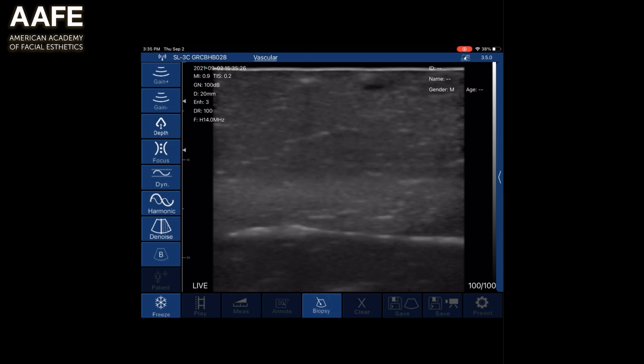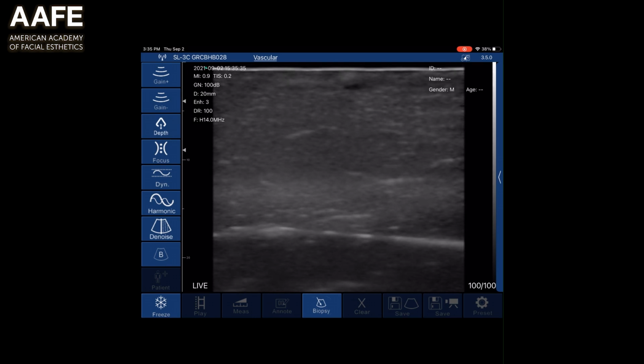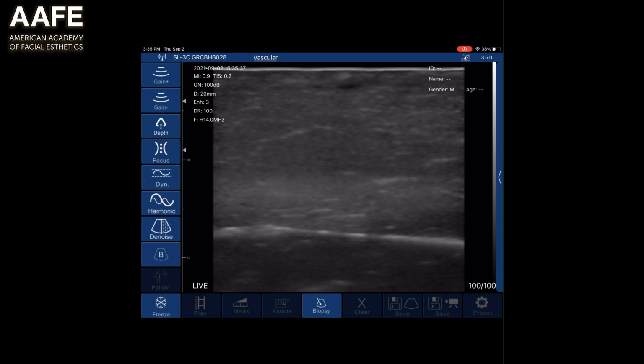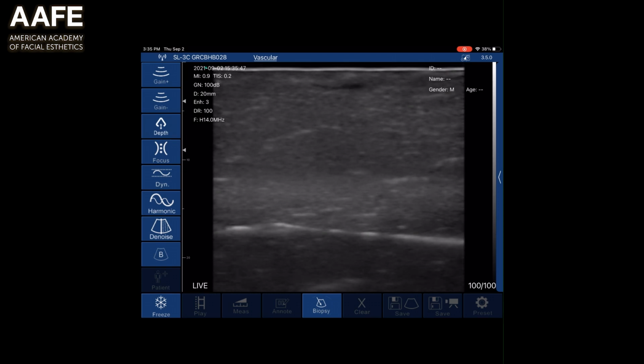Now, we did not touch this. Normally, we would be massaging it, make sure the hyaluronidase is getting into all the filler. We didn't touch it. We just let it sit. And now just watch it literally dissolve and see how long hyaluronidase takes to dissolve. It does not take very long. Now, do I need to flood this area with hyaluronidase? Not when I have an ultrasound, because I can literally go ahead and guide it in there.